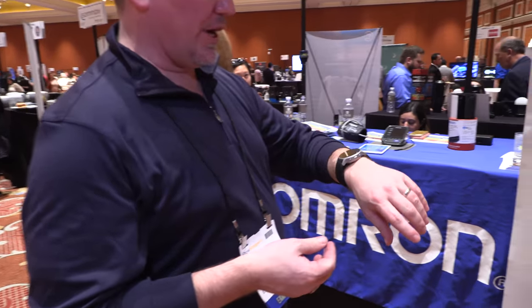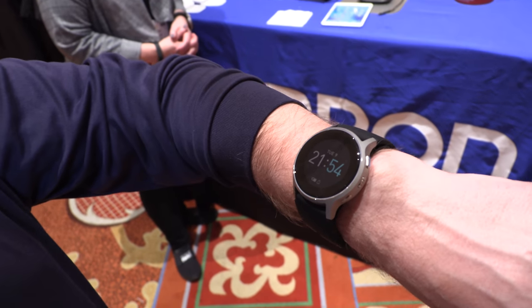And who are you? I'm Jeffrey, the Executive Director of Business and Technology. We're here demonstrating Omron's new wearable blood pressure monitor.